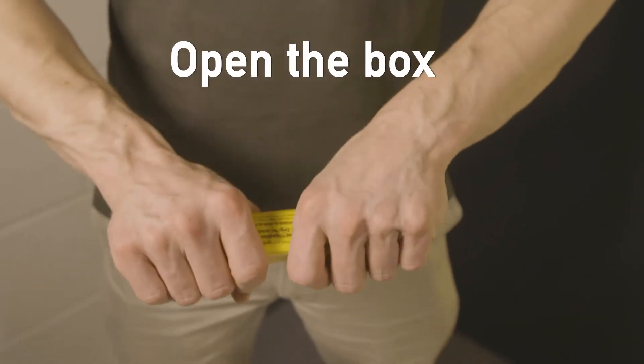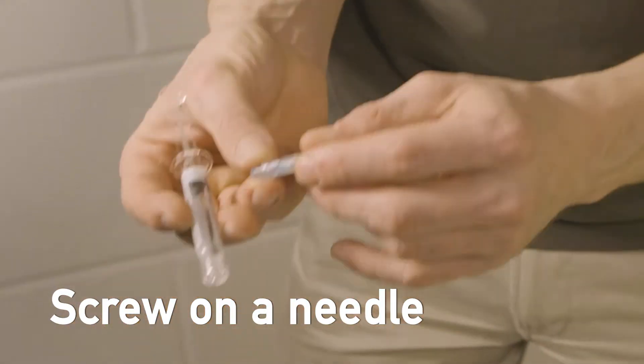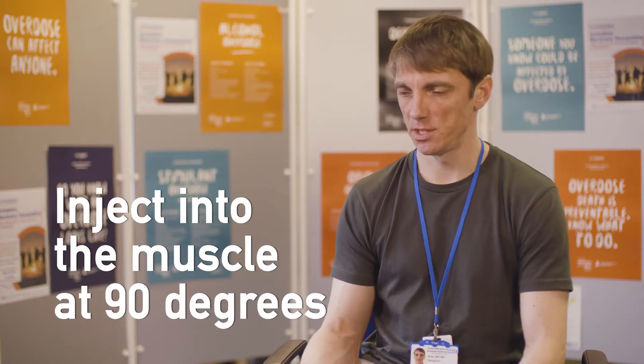You'd open the box, unscrew the cap, screw on one of the needles, take the cap off the needle, and you then inject into the muscle at 90 degrees. You can be quite forceful — you can go quite deep into the muscle.